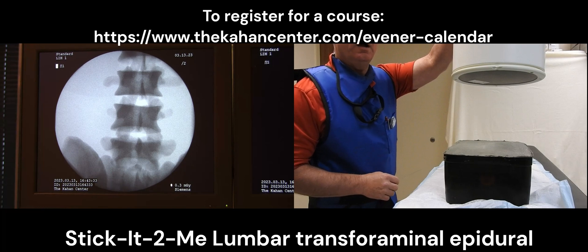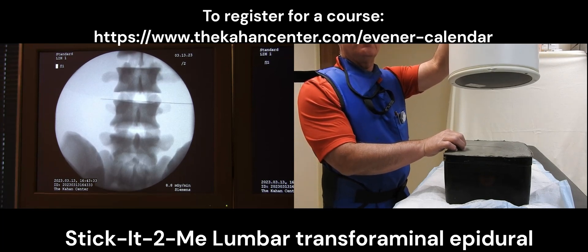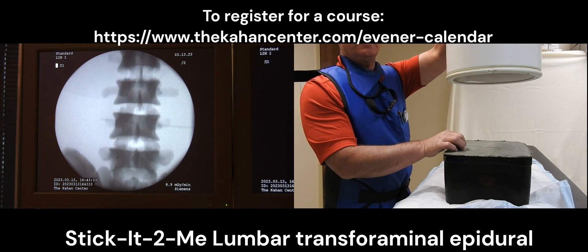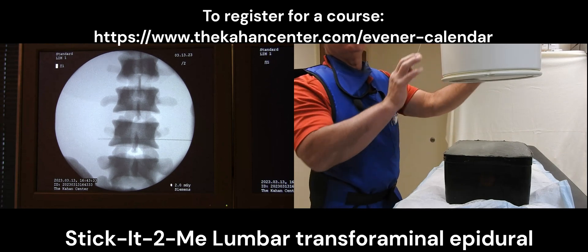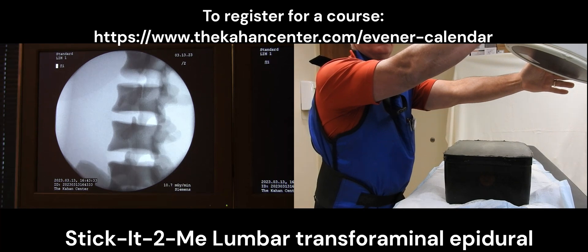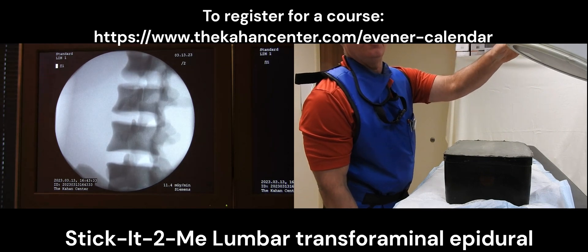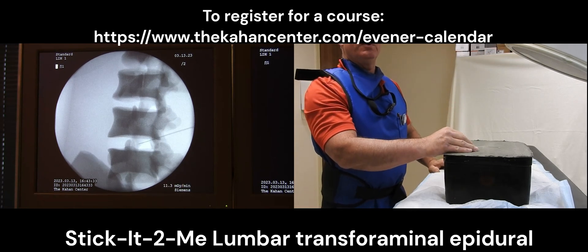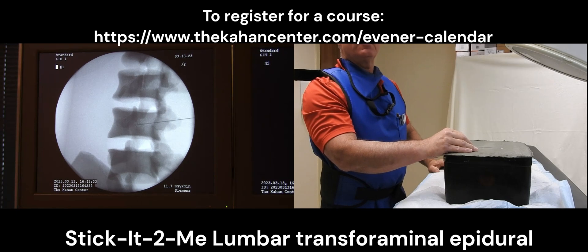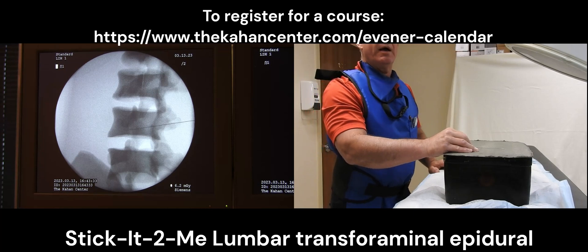Currently we're going to be doing an L4 transforaminal epidural steroid injection, which I have on the monitor. You can see that I have my vertebral body end plates lined up parallel at the area we're going to be working. I make sure my spinous processes are midline before I oblique it into a lateral oblique view, so that we have our superior articular process lined up underneath the eye of the Scotty dog. Our goal is to insert the needle underneath the eye of the Scotty dog and the nose of the Scotty dog, which is the superior aspect of the neural foramen.